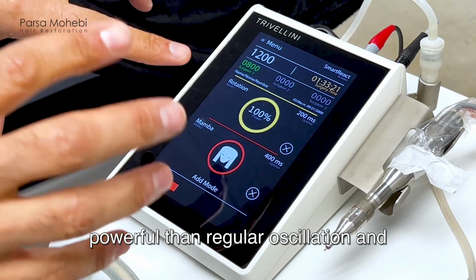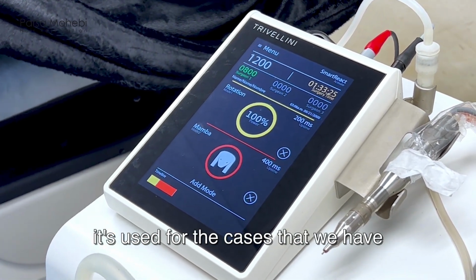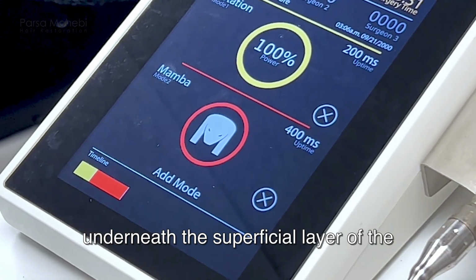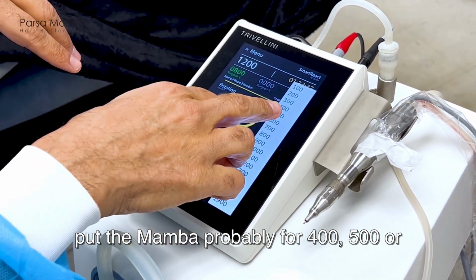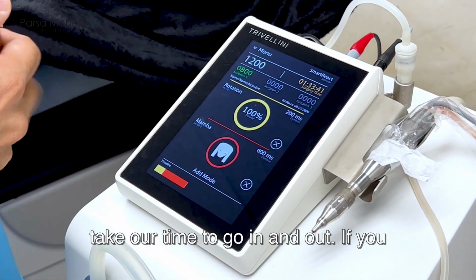It's more powerful than regular oscillation, and is used for the cases where we have scarring underneath the skin, or very thick or dense tissue underneath the superficial layer of the skin. In this case, we want to put the Mamba probably for 400, 500, or even 600 milliseconds, because we want to take our time to go in and out.